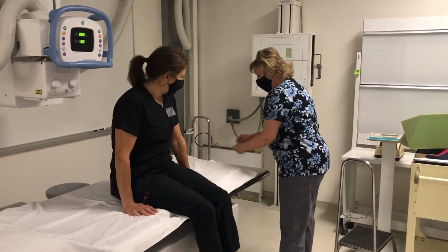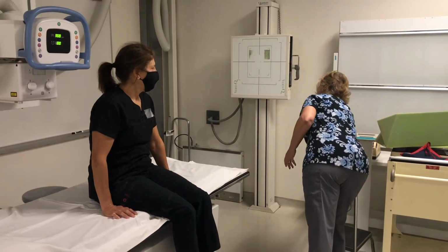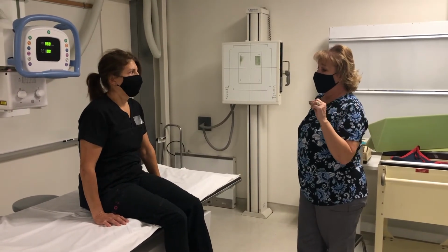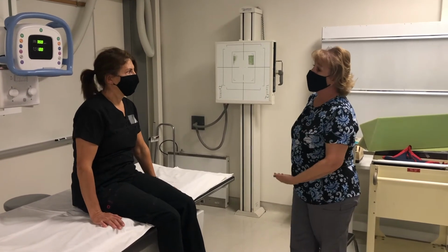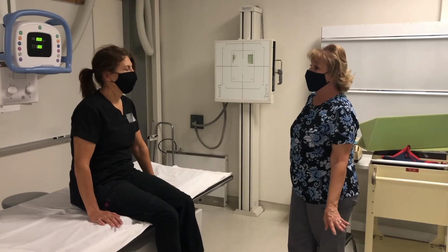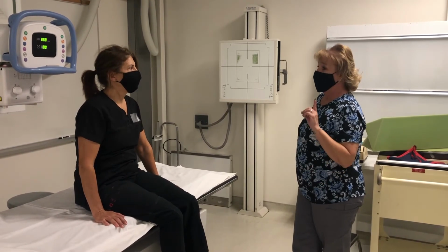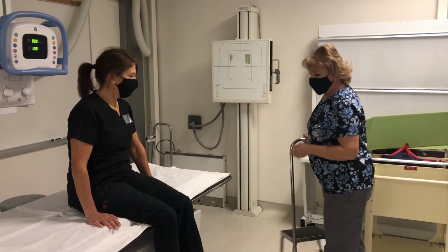So the imaging's almost done. Once you feel like you're feeling well enough, I'm gonna have you get up and go into the restroom right here. The contrast that we injected into your arm has now traveled down to your bladder and collected there. So you should be able to void that out of your bladder. And then once you feel like you've emptied your bladder, come back in the room, and we're gonna do one additional image, this time with you standing. Okay.